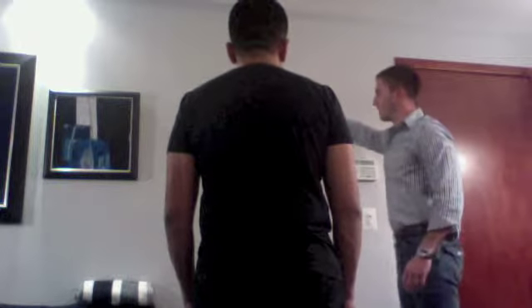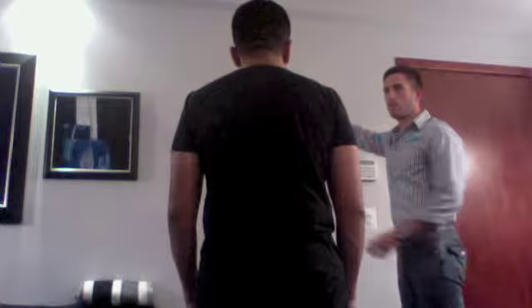And now we're going to check the patient's height. So we're going to extend the ruler on the top. Then you want to ask the patient with the back towards the wall to step up.